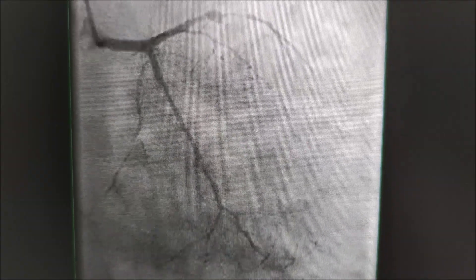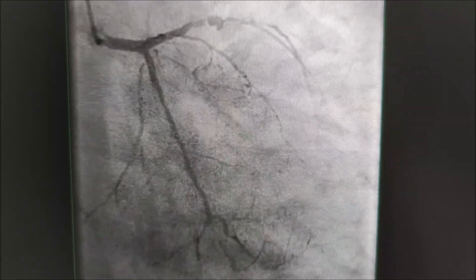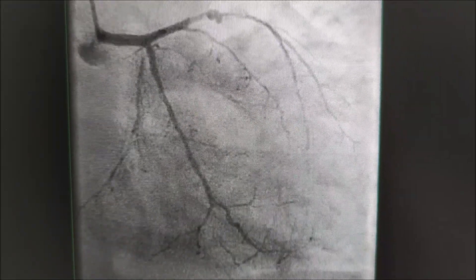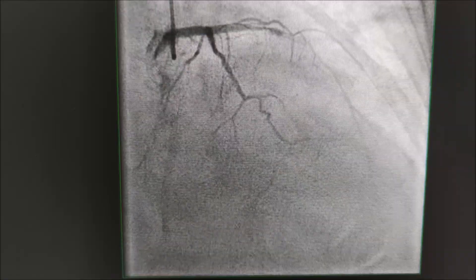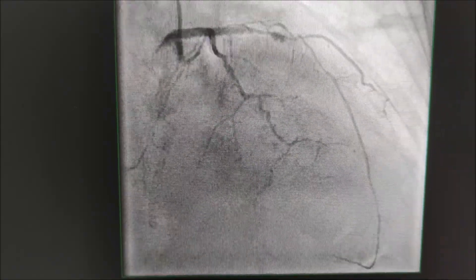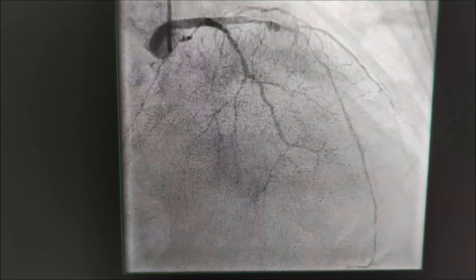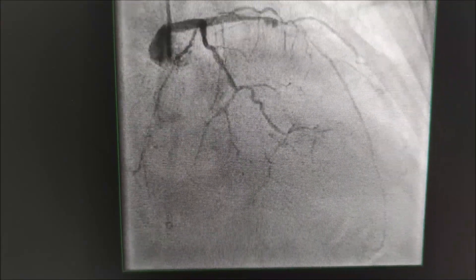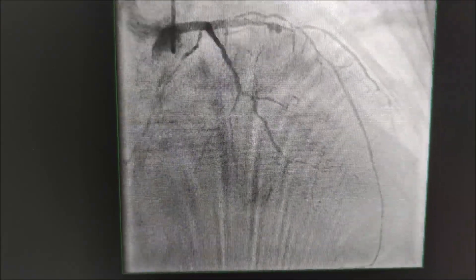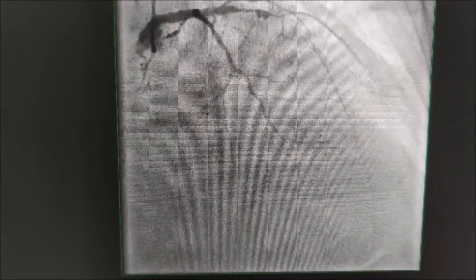On the left coronary system you can see only mildly diseased left circumflex. The LAD is heavily atherosclerotic and diseased with a medial ectasia directly in front of an old stent, while the vessel is subtotally occluded.